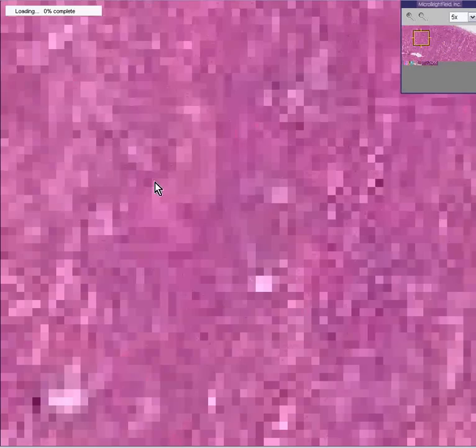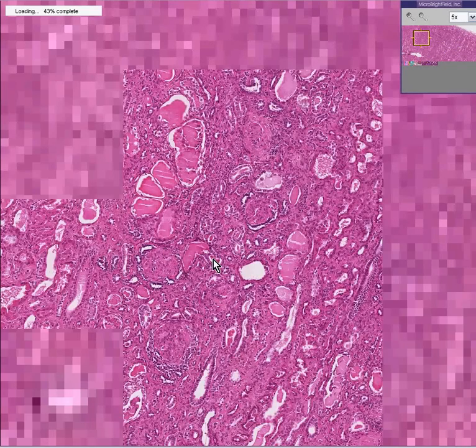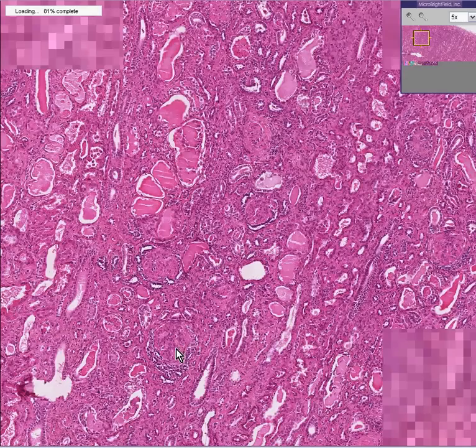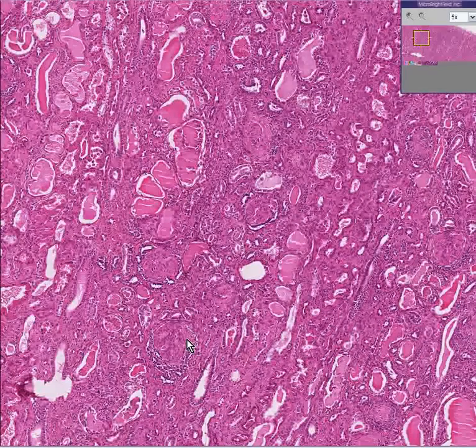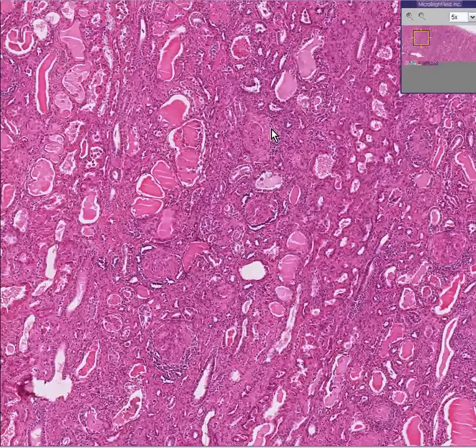How many normal glomeruli do you think we'll see in this field? I can see one that's largely replaced by fibrous tissue, surrounded by inflammatory cells. There's an abnormal one here, abnormal one here, abnormal one here. I don't see any nice-looking glomeruli in this field.